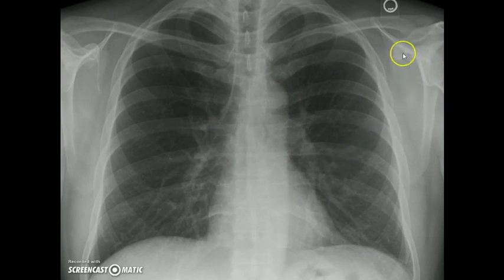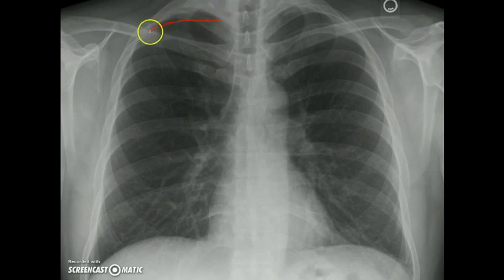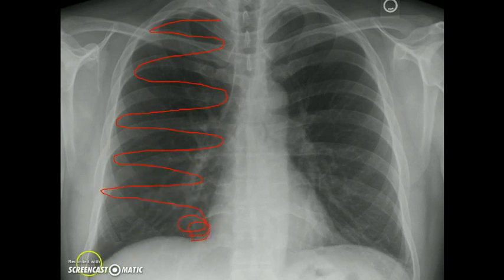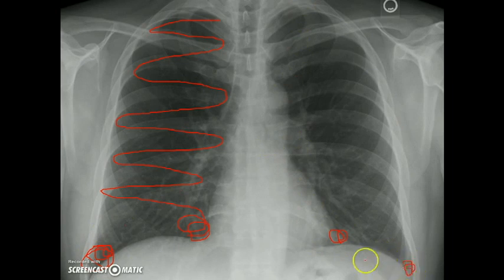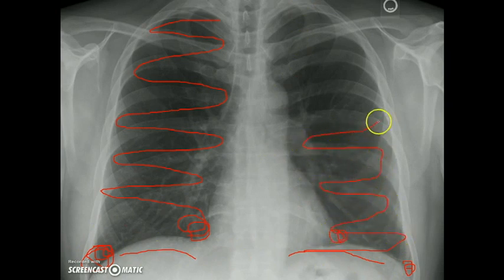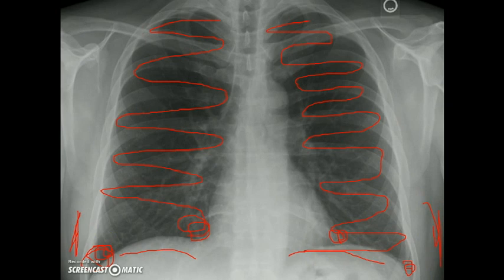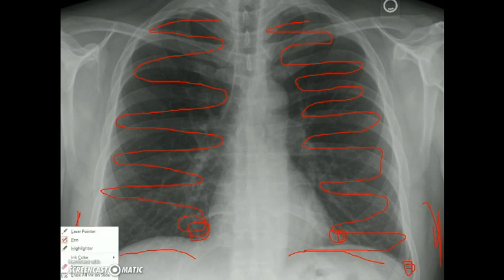After the mediastinum, go in for the air spaces. You see the lung — start from one side, go across concentrating on the black part, the air shadow. Look for the cardiophrenic angle and the costophrenic angle. During this time, also see the domes of the diaphragm, then continue to the opposite side, concentrating on the air shadow throughout. Finally, see the subcutaneous spaces — the soft tissue shadow — to check whether there is any subcutaneous emphysema or surgical emphysema.